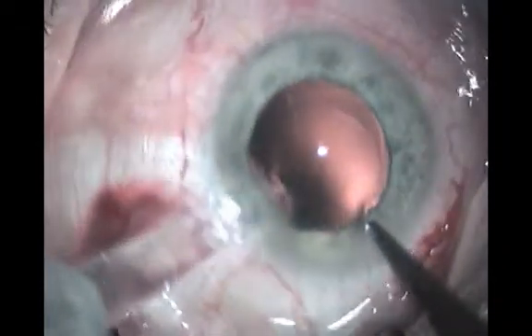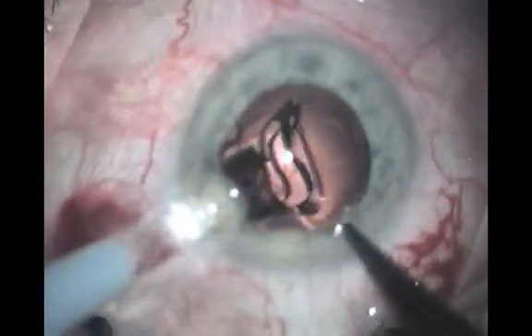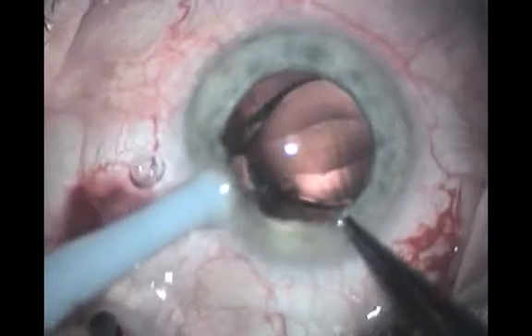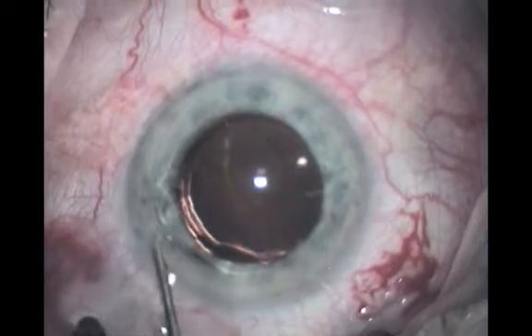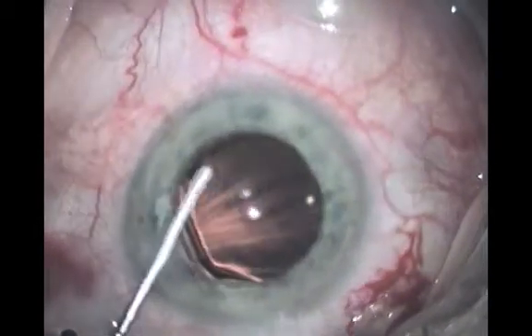Safe gentle insertion of a Raynor IOL. Most of the time, insertion and dialing of a modified Z-loop or C-loop type IOL is relatively easy and does not pose any significant problem.